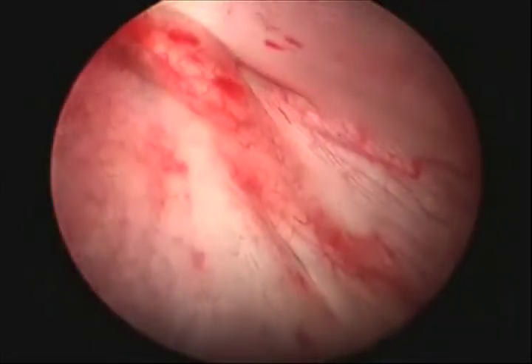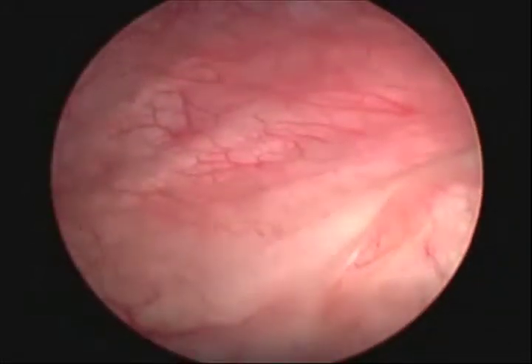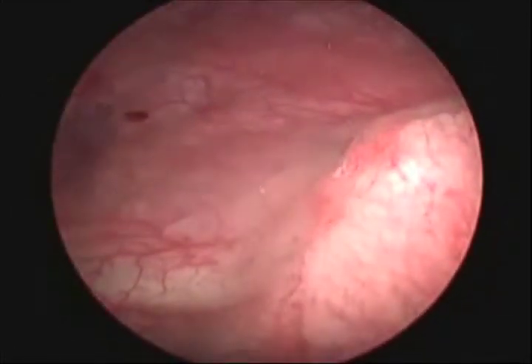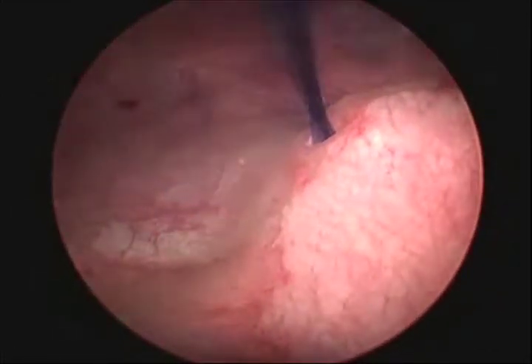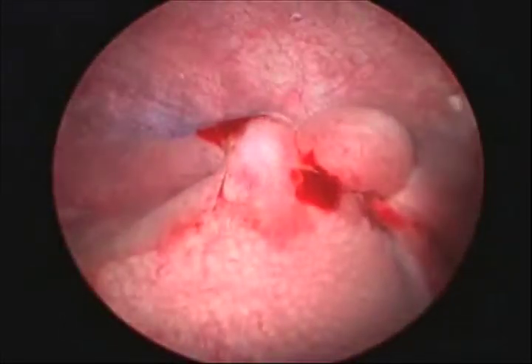The administration of indigo carmine dye following completion of the repair further confirms the patency of the ureters. Had the indigo carmine dye been given during or prior to completion of the repair, the presence of the indigo carmine dye may not necessarily confirm complete patency of the ureter.